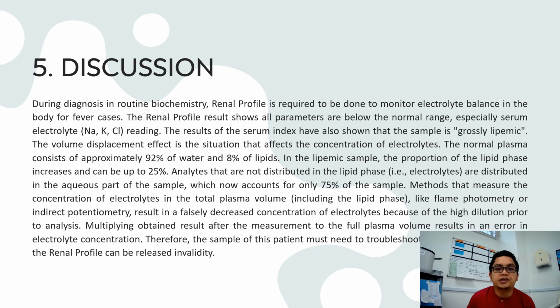During the routine biochemistry, renal profile is required to be done to monitor electrolyte balance in the body for fever case. The renal result shows all parameters are below the normal range, especially serum electrolyte, sodium, potassium, and chloride reading. The result of the serum index has also shown that the sample is grossly lipemic. The volume displacement effect is the situation that affects the concentration of electrolyte.